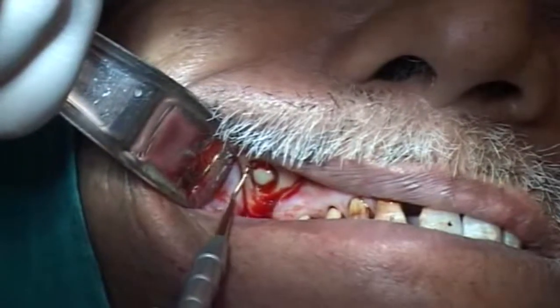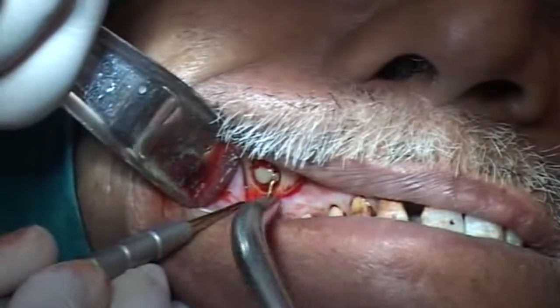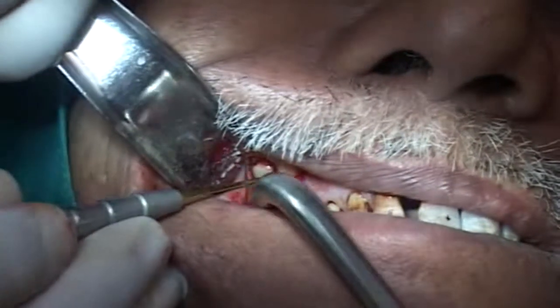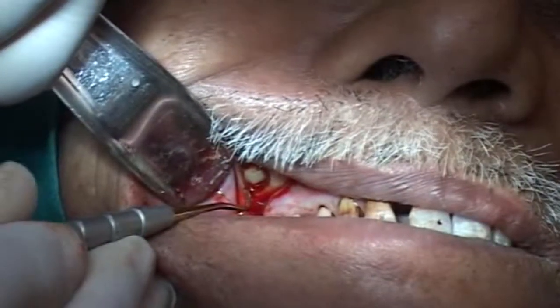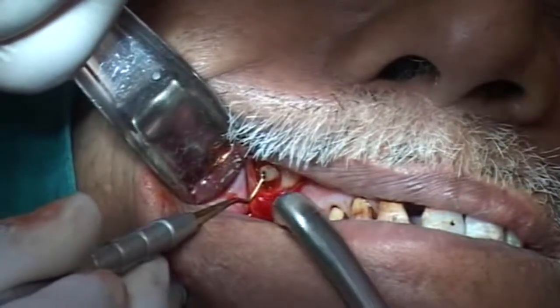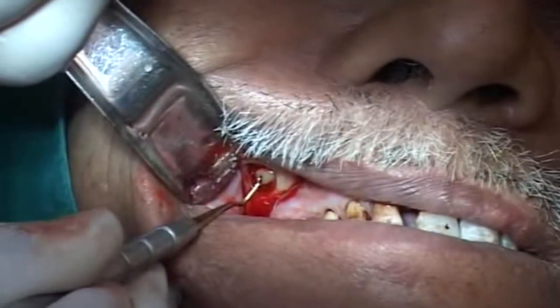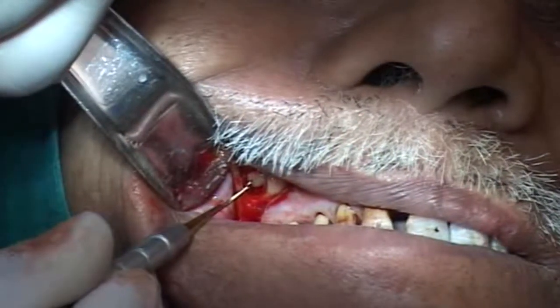Once this small bone piece is separated from the rest of the bone but remains intact with the schneiderian membrane attached to it — maintaining the blood supply — we use a delicate instrument to separate the schneiderian membrane from the outer bone all around it, keeping the schneiderian membrane intact with that particular bone piece. There is no need to go deeper.